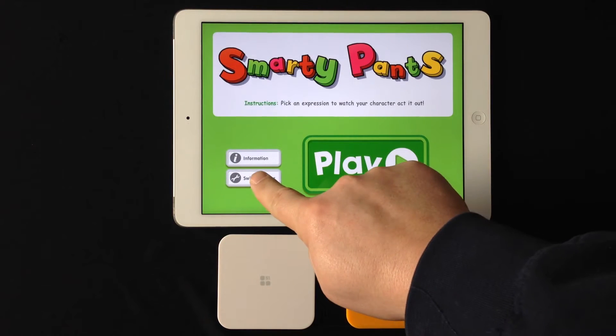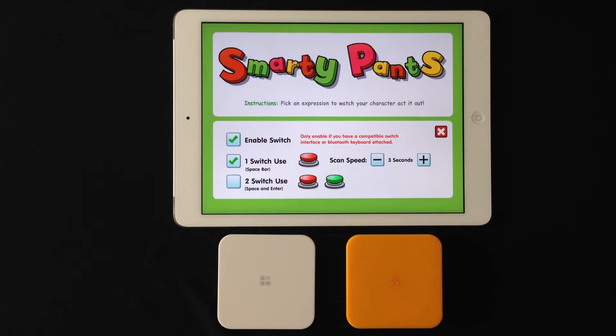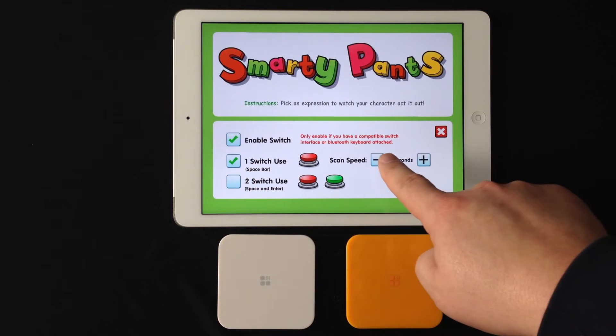To set this up, just go into switch settings and you're going to enable switch. Make sure your Bluetooth switch is paired with the iPad before you get in here. You can use mode 1 or mode 2. We'll just use a single switch and we'll leave the scan time.